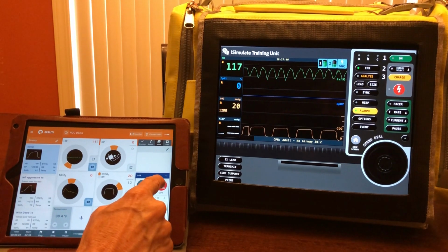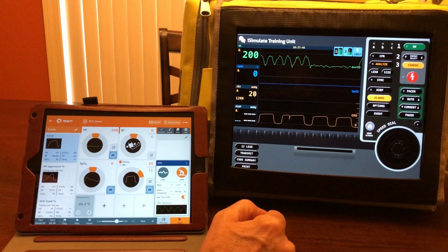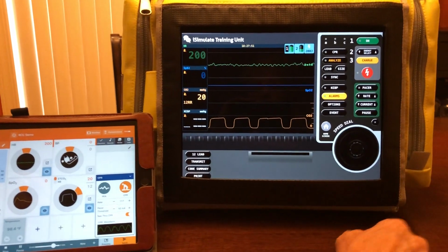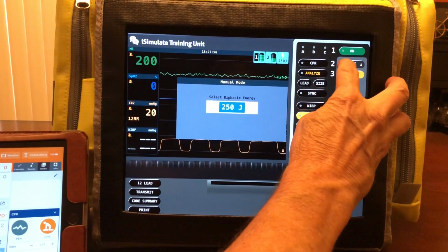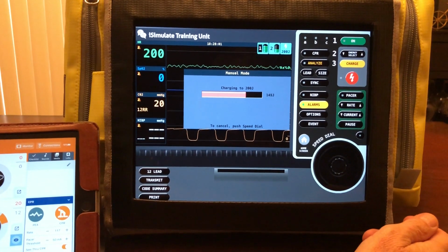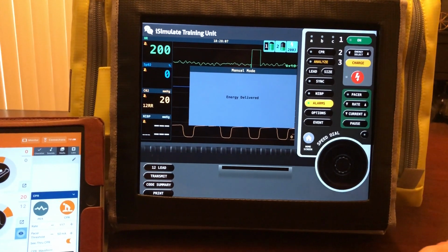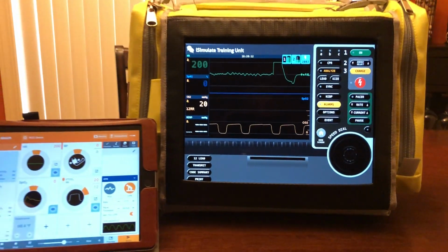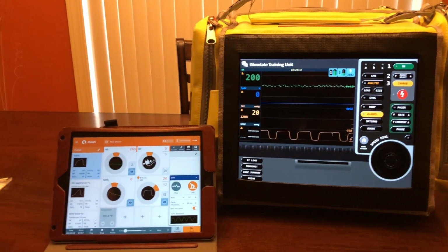So as soon as they stop CPR to check the rhythm to deliver a shock, then it shows them the underlying rhythm. And just with the ALSI system, if they recognize this as shockable, they're going to hook up their defibrillation pads. They're going to choose an energy level. They're going to charge it up. Hopefully clear their patient, and they're going to shock the patient. Energy is delivered. We can preset our scenario to determine whether or not that shock is successful or whether the second or third shock is successful, and then it'll jump to another rhythm.